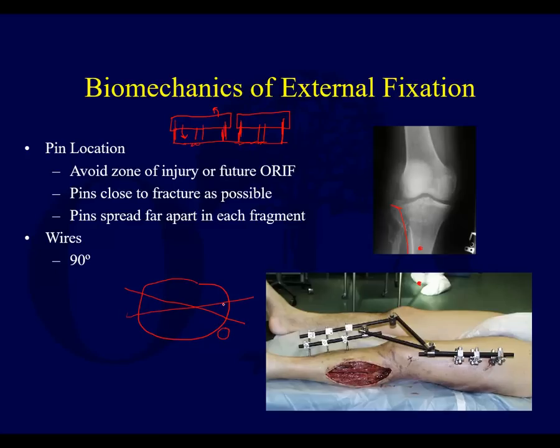Only leaving wires at a shallow angle means the fixation is acting kind of like one pin. This is an axial view of the tibia — when this patient flexes and extends the knee, it acts almost like you've just got one pin.